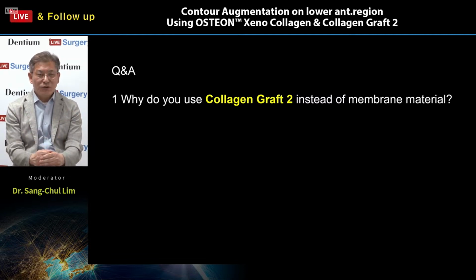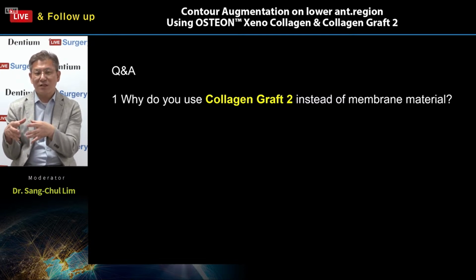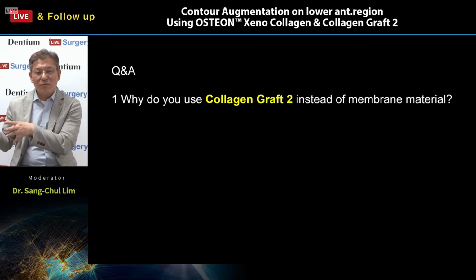So finally, I can recommend: if you want the original concept of the GBR procedure, you have to use a collagen membrane as a barrier.